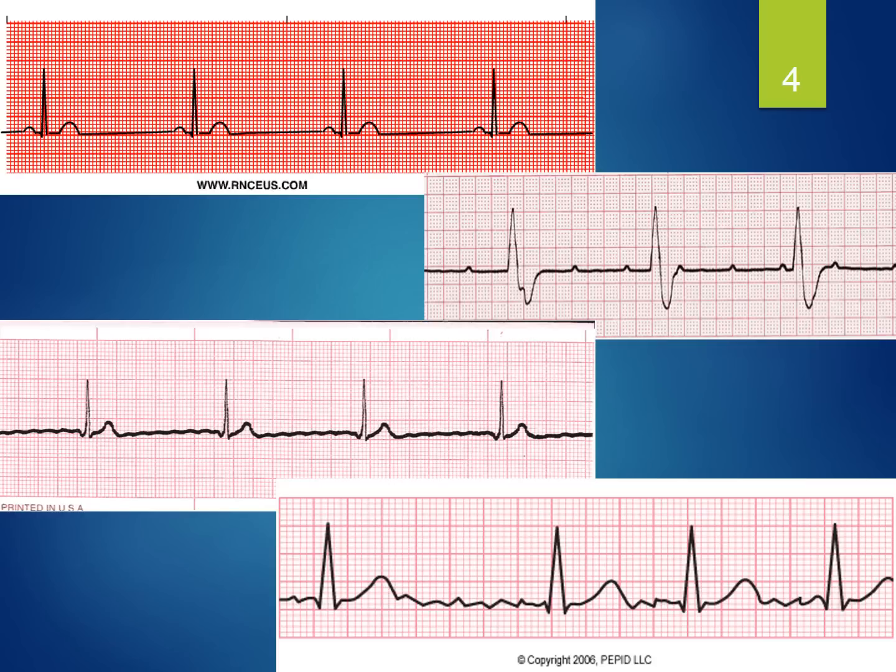However, remember that atrial fibrillation is caused by unpredictable chaos, fibrillation in the atria. And at times, this can result in an unpredictably low amount of electricity getting past that AV node and causing a ventricular contraction. So we may just see atrial chaos, but not enough ventricular responses. So this last one is pretty rare, but just keep in mind, all of these strips have something in common. It's a slow heart rate. There's not enough R waves.